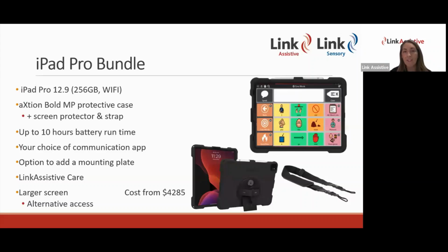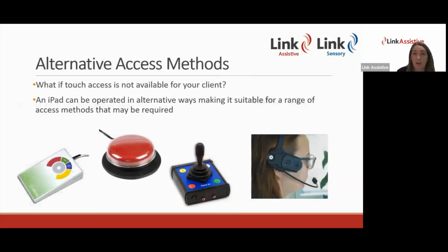I guess with a larger screen size, it may also lean towards becoming more of a device that you might use for alternative access methods. So there are ways in which an iPad can be operated when maybe touch is not accessible for your client.